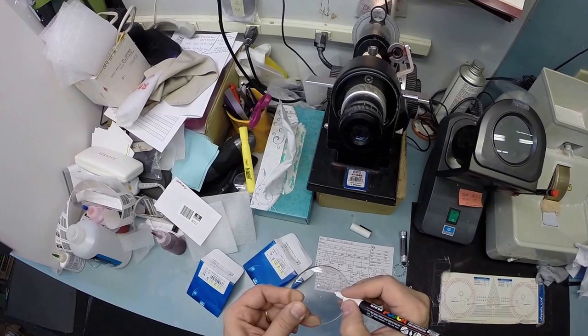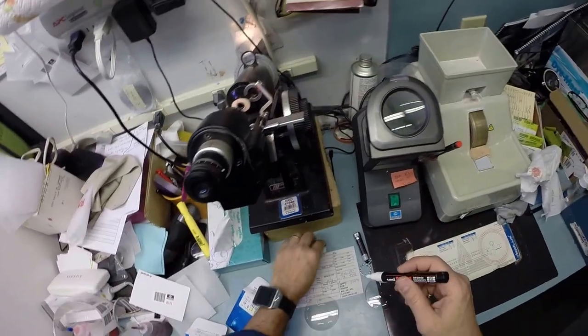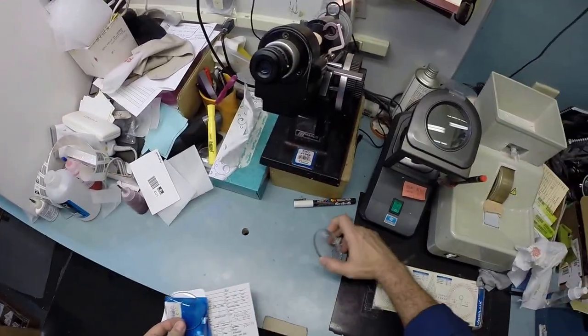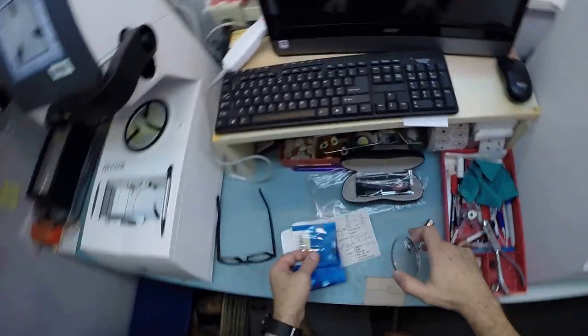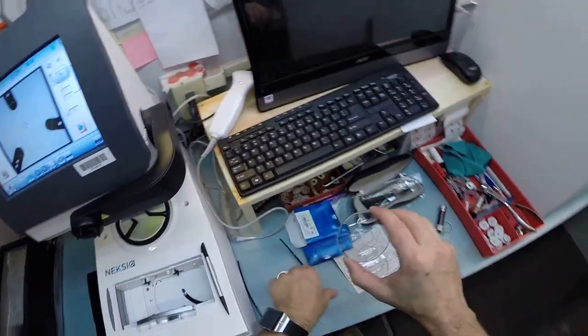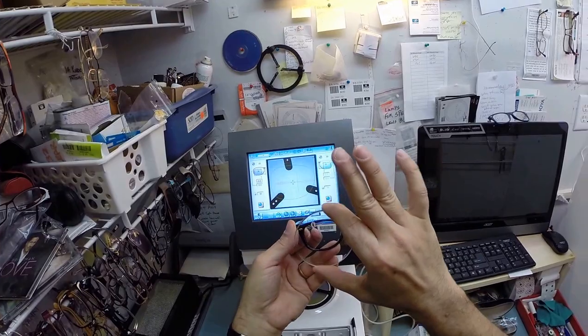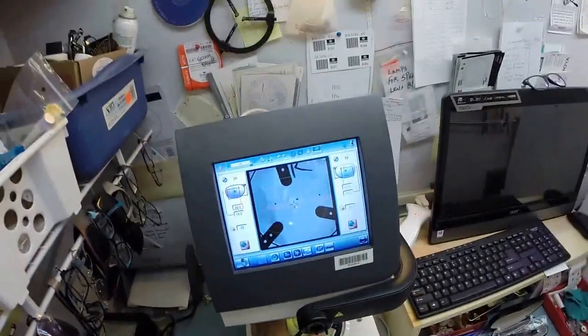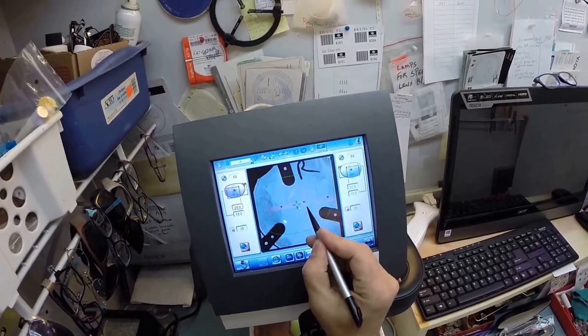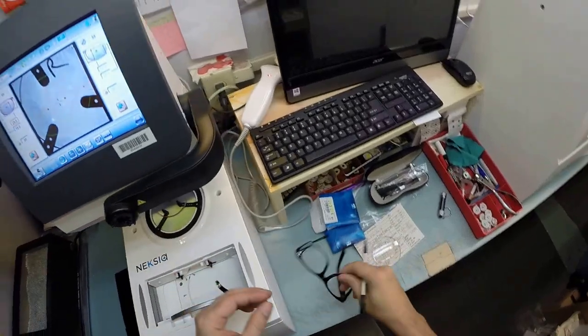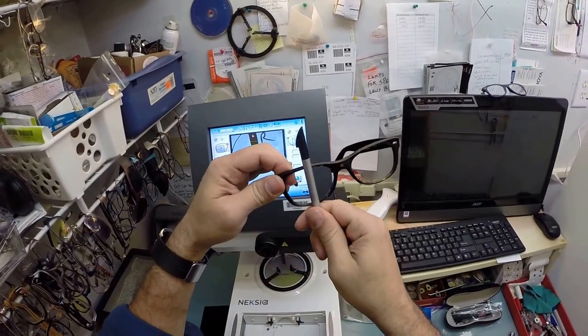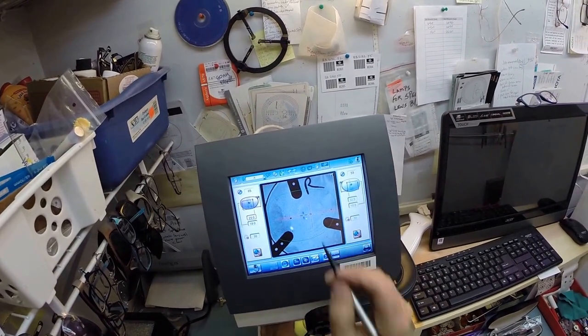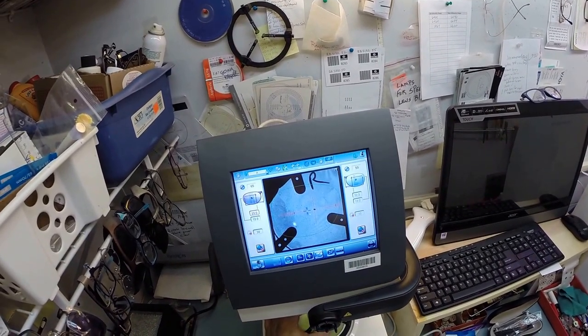The reason why I put those dots on there is it shows me exactly how your lenses have to be oriented in the frame. Those white dots show up black on my screen. That one in the center is your optical center. That blue cross is the geometric center of your frame. If I was to measure vertically and horizontally, this would come up like the crosshairs of a scope. I'm going to move that inset just a little bit to get everything lined up perfectly.